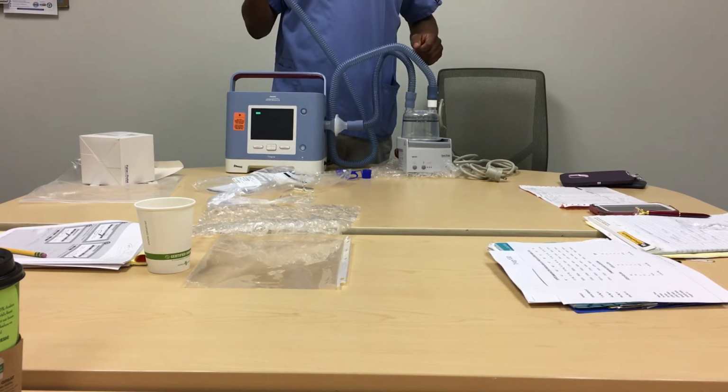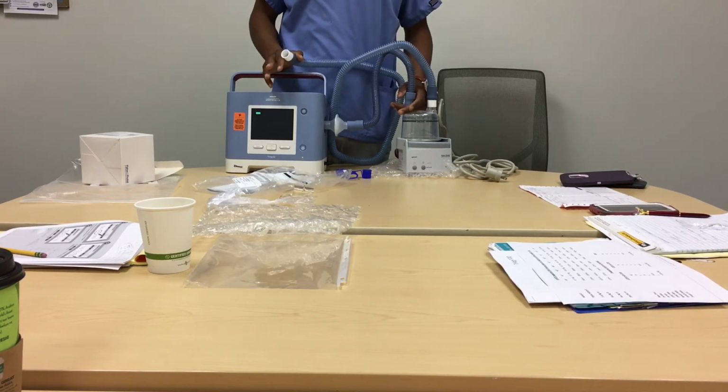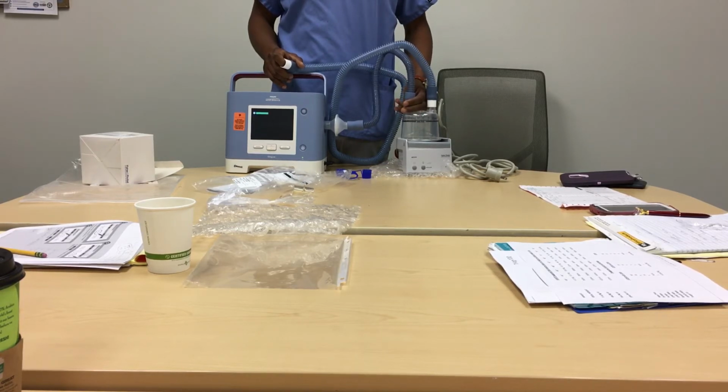So typically, do you go HMEs, or does everybody start on this? There's a lady I'm working with now that we went straight to it. HMEs, yeah. By the same token, I've seen patients that go directly to this. So it just kind of depends on the patient.